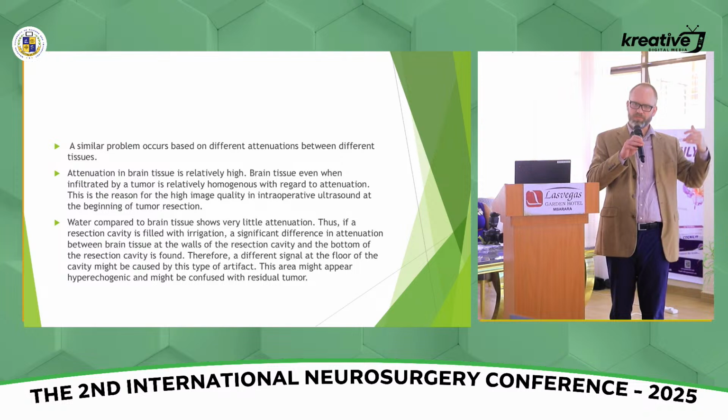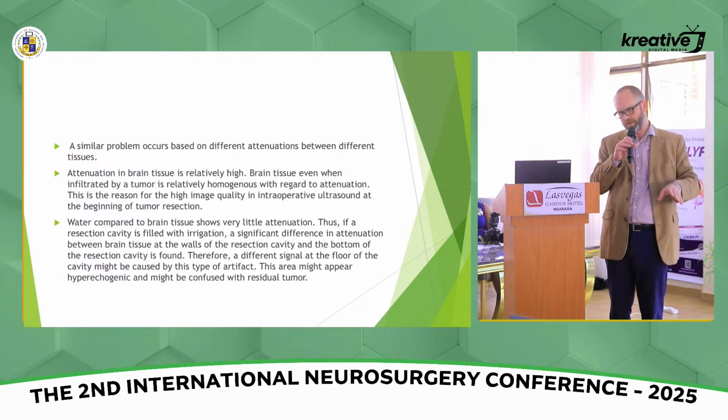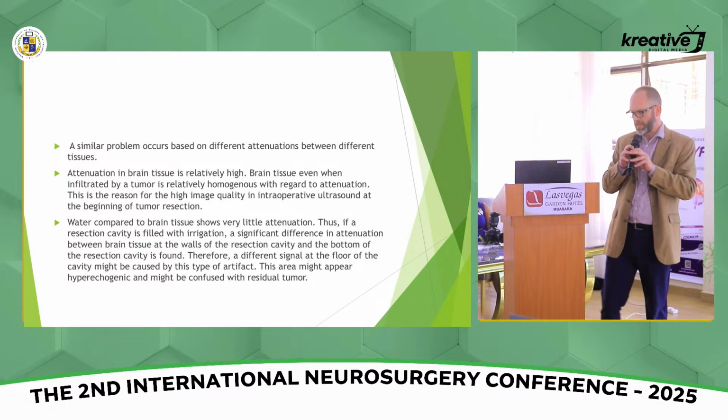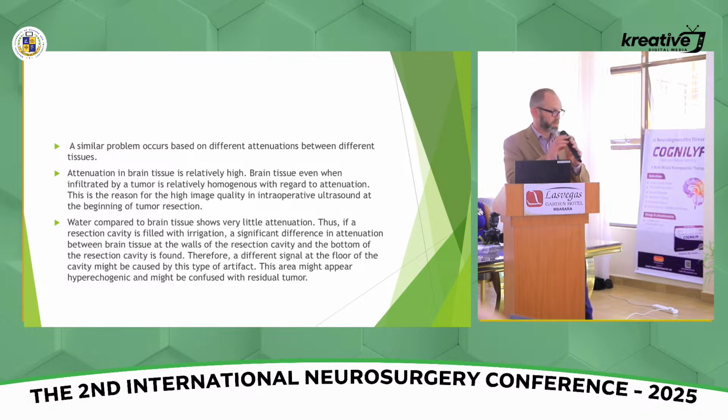You can actually put the ultrasound on the brain instead of right over the fluid-filled cavity and look at that same tissue. If you're only going through brain to it, now see how the base of the cavity compares to before, and does it look the same as surrounding white matter? That can help you distinguish that artifact.